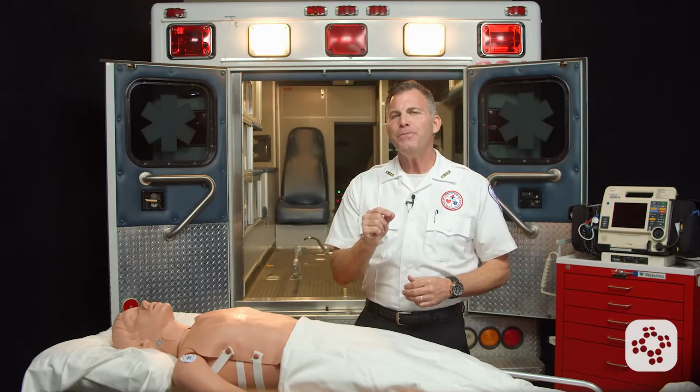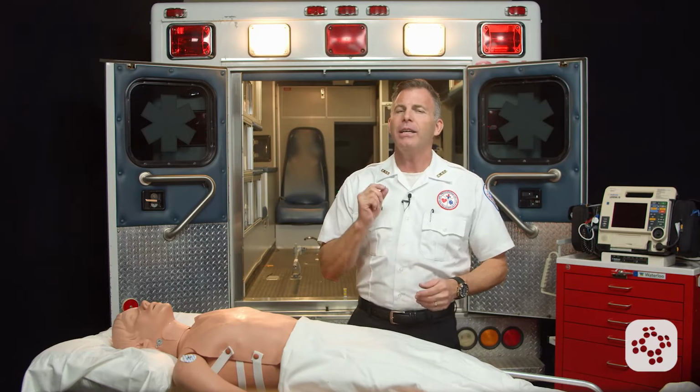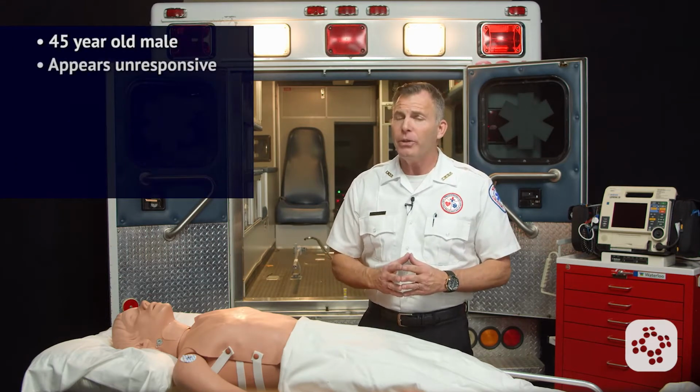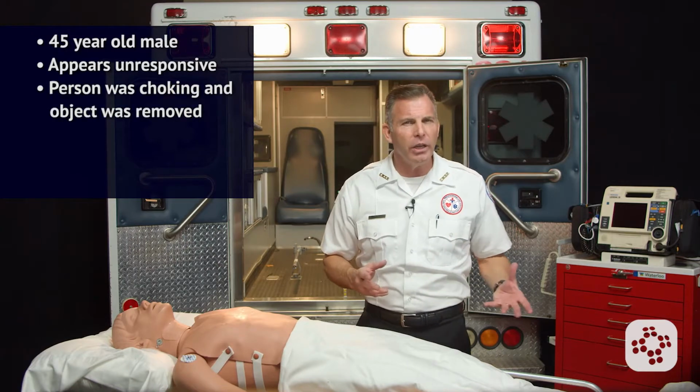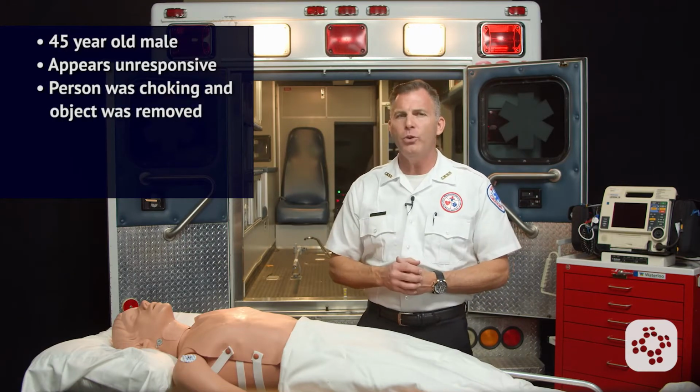In this next scenario, it's called a Megacode, and it combines the knowledge of procedures and treatments from multiple ACLS algorithms. In our scenario, you'll be the ACLS team leader with a 45-year-old male patient who appears to be unresponsive. A witness states that the person had a choking emergency where an object was removed.